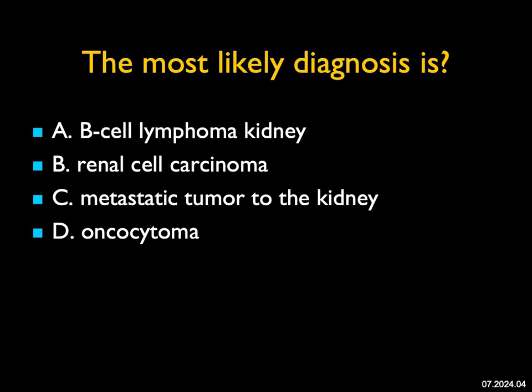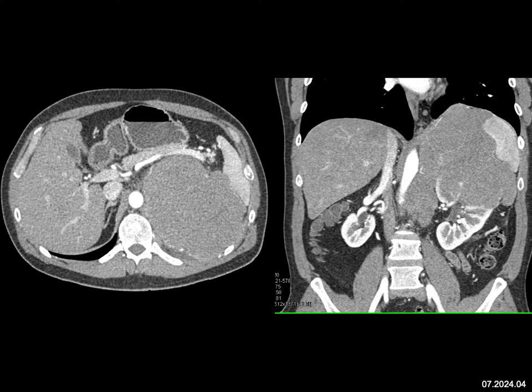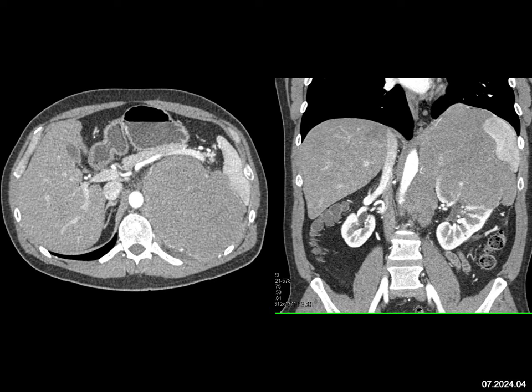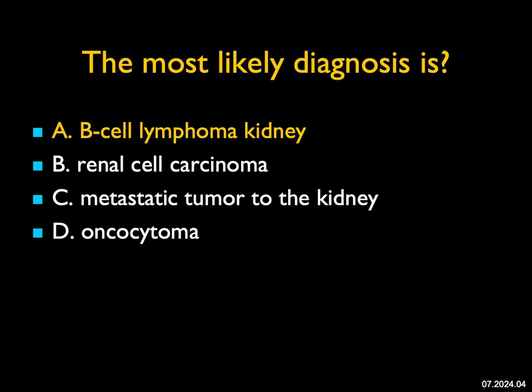The most likely diagnosis in this case: we see a large mass infiltrating the upper pole of the left kidney. It seems to involve the spleen, the adrenal bed, possibly extending to the stomach and periaortic region. You see adenopathy. This could be renal cell, but there's more of an infiltrating process than we typically see with renal cell, surely clear cell. Mets to the kidney are usually well-defined single or multiple, and oncocytomas are typically well-defined. Lymphoma of the kidney, however, can be very large, can be infiltrating, can involve adjacent organs. There's a range of appearances for lymphoma — from solitary to multiple masses, often bilateral — and peri- and pararenal space involvement is not uncommon, which was indeed the case in this patient.